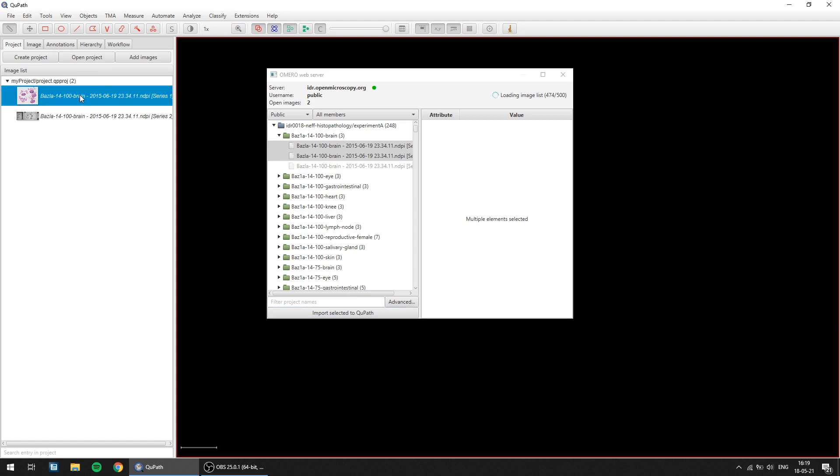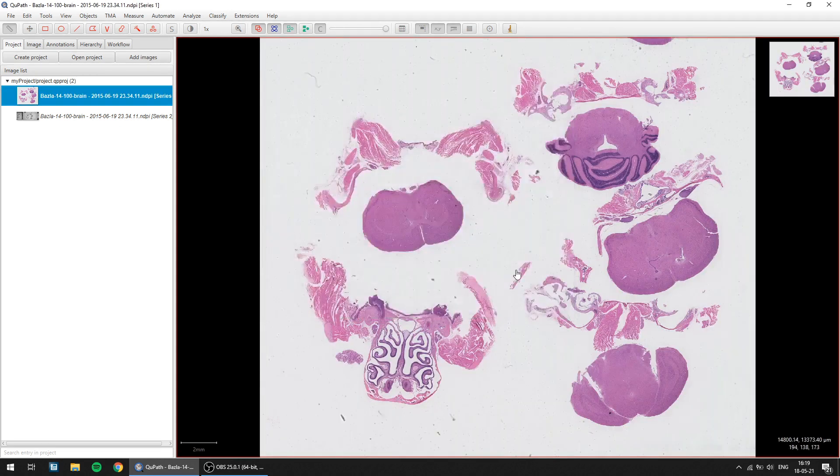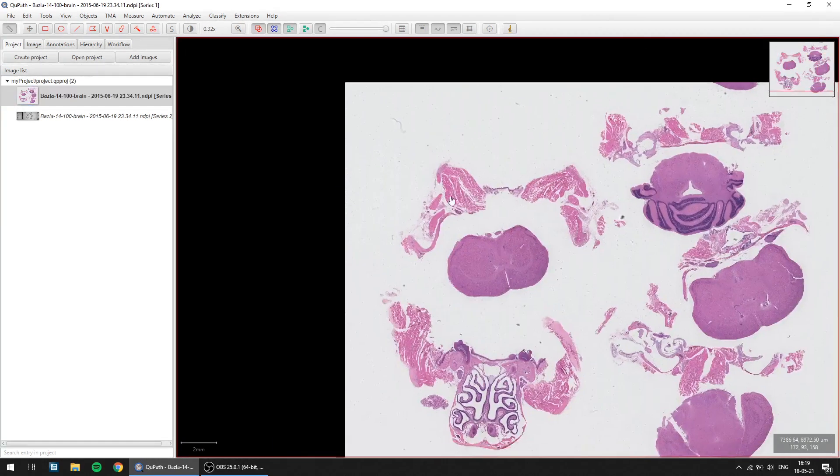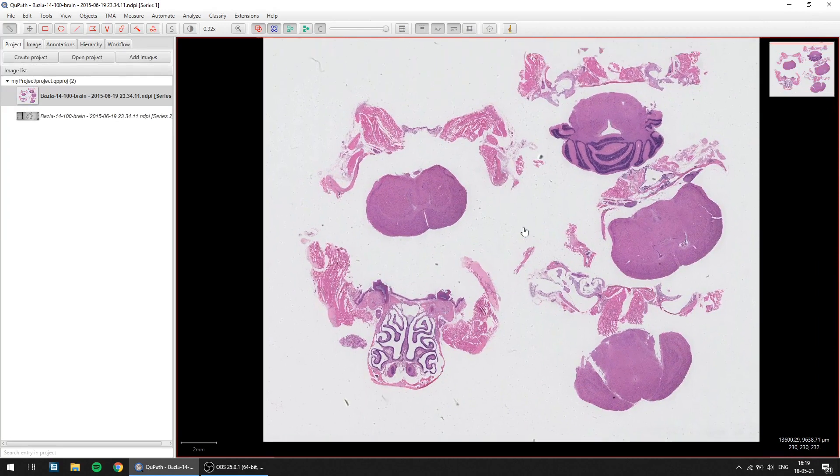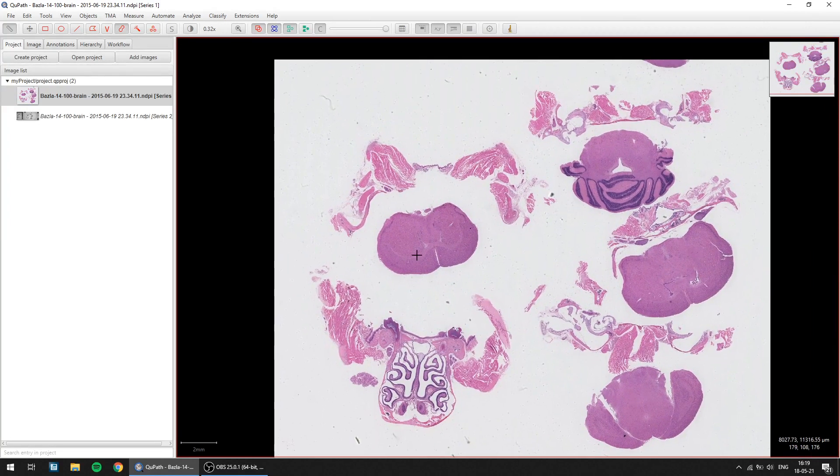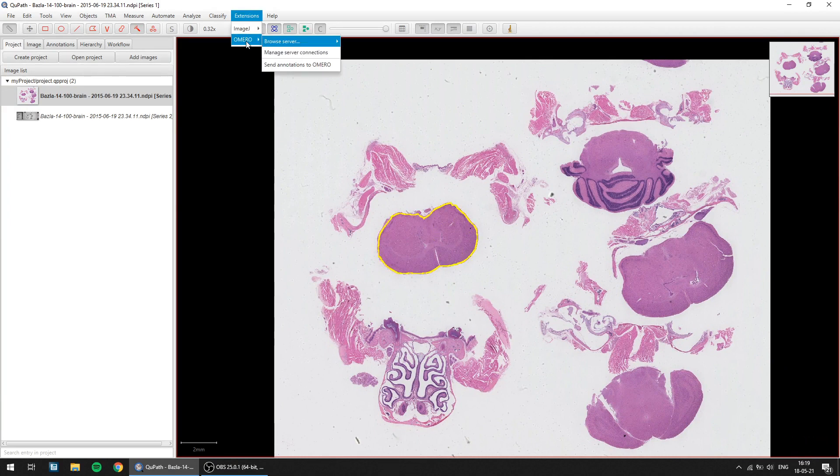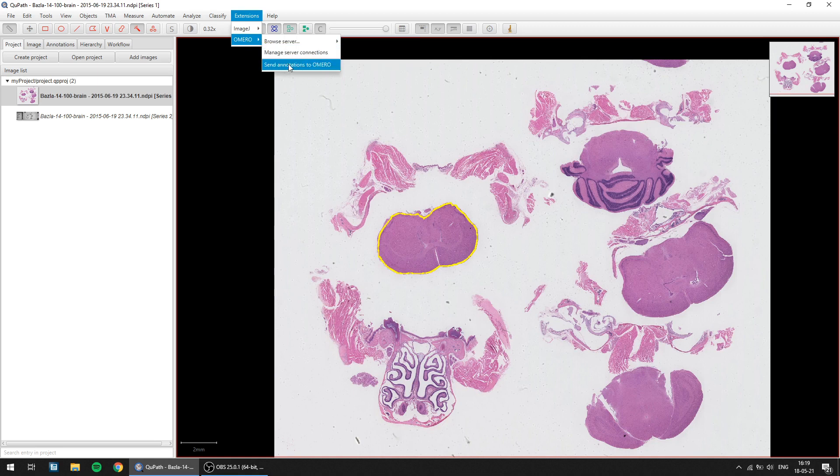You can then open them and zoom in, zoom out, and also create annotations, for instance here, use a wand tool. You can also send them back to the Omero server with the right command and do all types of analysis.